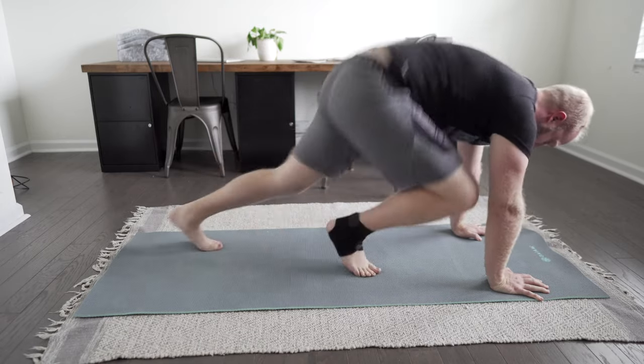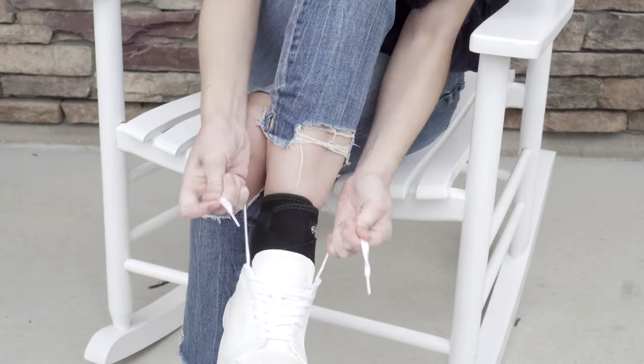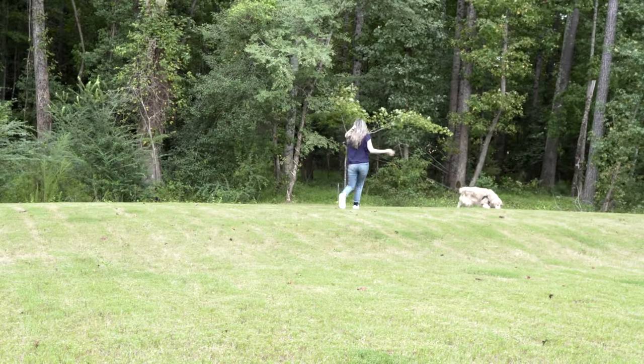The Bodyprox brace is great for any of these injuries and can help to support your ankle and speed your healing time. Our brace is also designed to prevent these injuries, if you have issues with weakness in your ankle, or to provide protection during sports, recreational, or occupational activities.